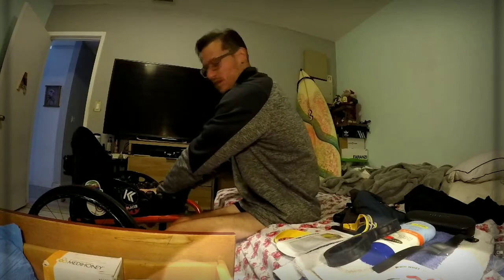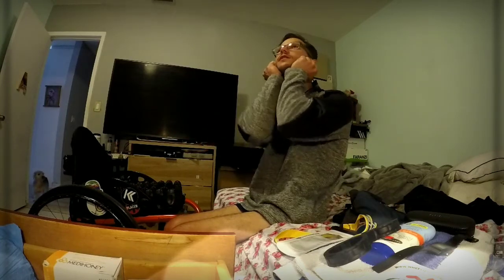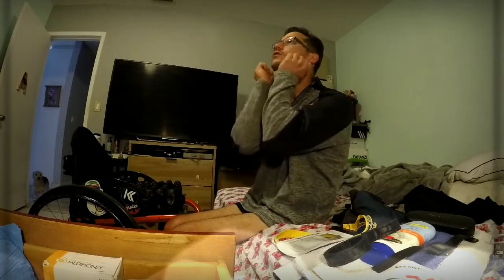I'm going to do it to the whole front, to be honest, because I'm getting a new cushion and it's going to have a scrotum relief, so my testicles have some room to fall under me, so I'm not pressing and not adjusting so much, and not bringing them up. It's always like that, either maybe to the right or to the left a little bit, but I try to put it in the middle or a little to the left, and it's always like that, always.